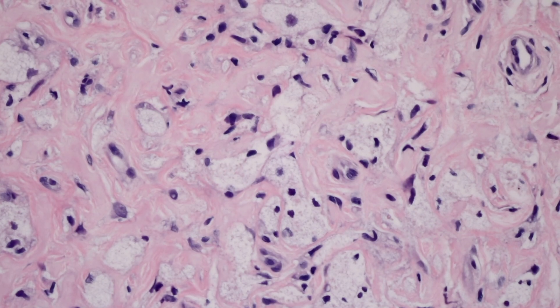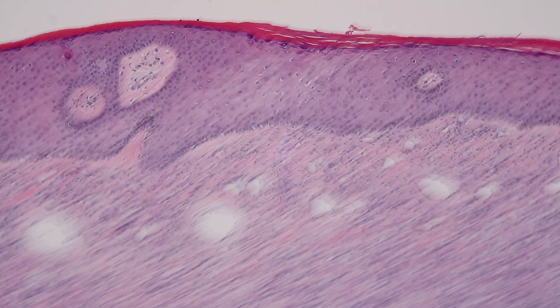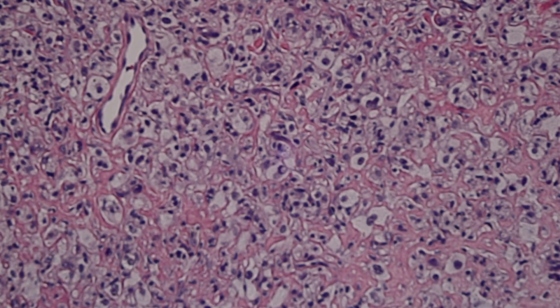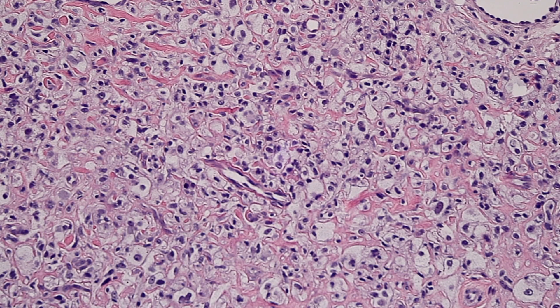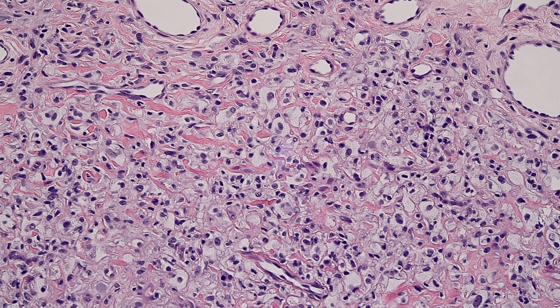We have true foamy histiocytes in abundance, just like you'd see in a xanthoma, but these rings and arcs of dense sclerotic pink collagen in the background, the anatomic site, and - if you have the epidermis or periphery of the lesion - epidermal changes and collagen entrapment will show you you're dealing with a Dermatofibroma rather than a xanthoma. Although both lesions are benign, some xanthomas are associated with serum lipid abnormalities, whereas lipidized DF, to my knowledge, are not associated with lipid abnormalities.